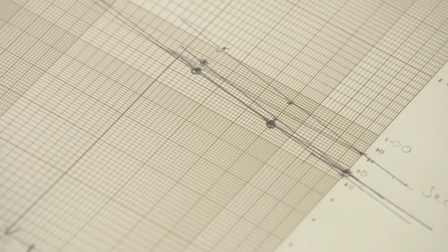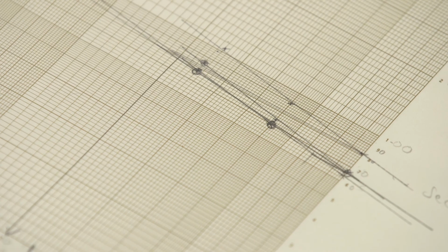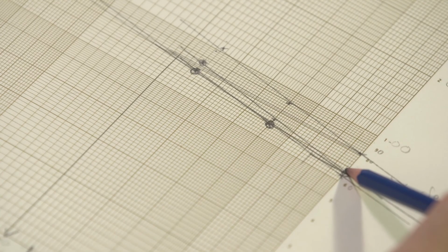So it's not possible to give a fully accurate estimate of the factor VIII concentration. But what we do know is that the higher dilutions will move closer and closer to the truth, closer to the real answer. And if we can obtain 2 dilutions which would give a straight line that's parallel, crucially, to the standard, that's an indication that we've diluted away the inhibitory effect. And if that occurs, then I think it's safe to use those 2 dilutions to make an estimate of the factor VIII activity. In this case, we've got false prolongation with the first dilution.